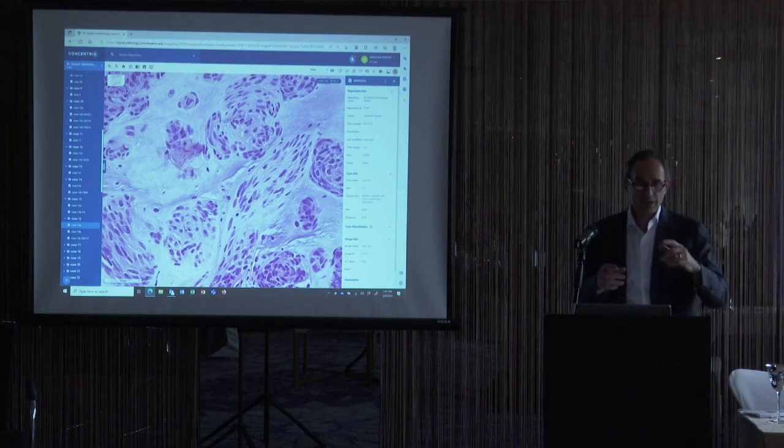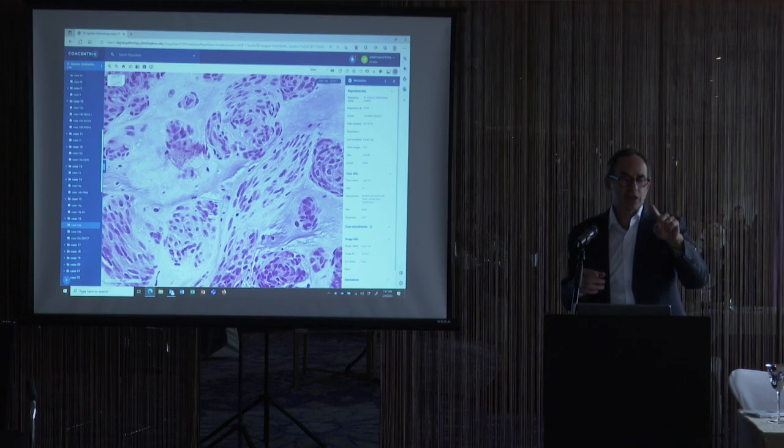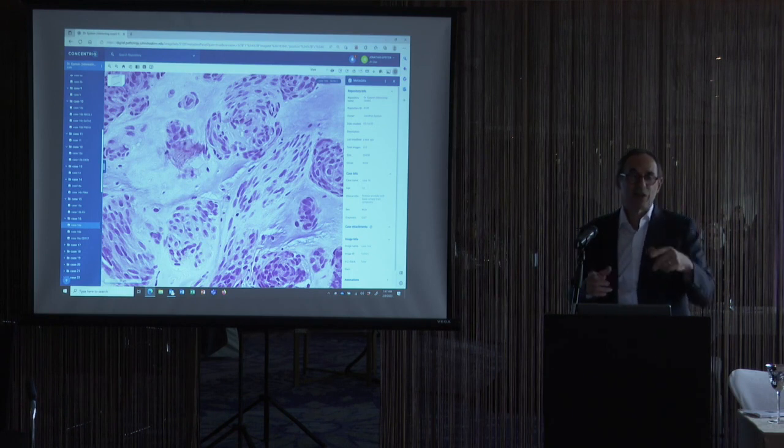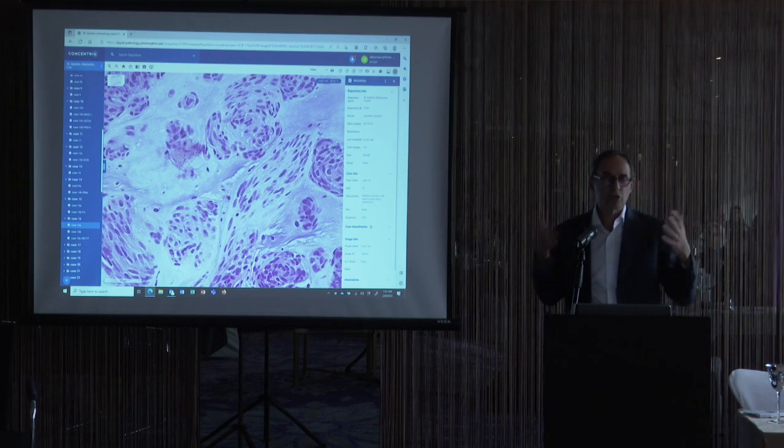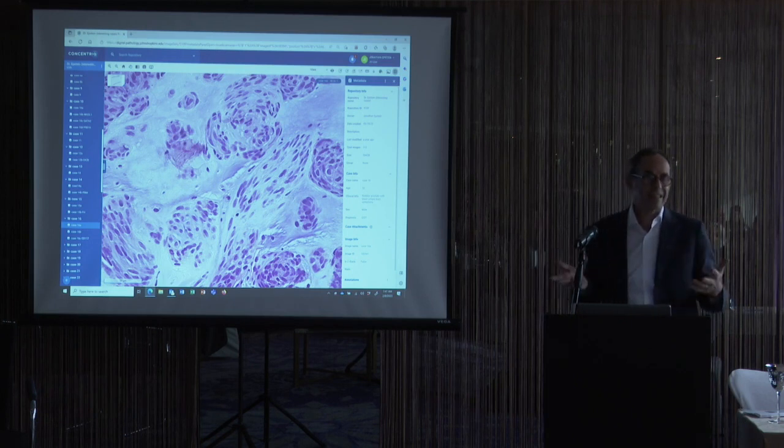I've also had some cases where the urologist on the rectal exam felt a nodule, and he wanted to biopsy the prostate, and he kept trying to push the nodule away just so he could biopsy the prostate, and then went through the nodule, and it was a GIST. So you have to think of GIST, because it's just not in your differential diagnosis of a prostate lesion.